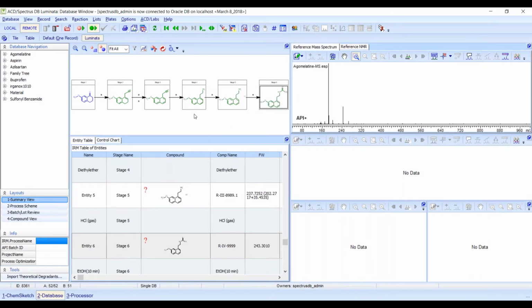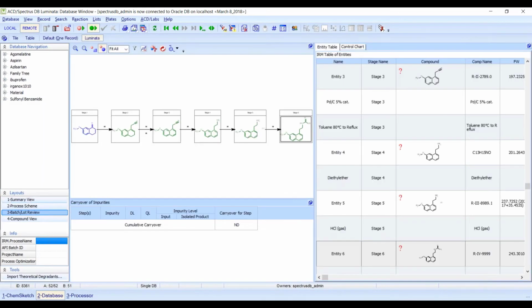Now, in this case for the webinar, I really want to focus on a differing screen form, so maybe more of a process screen form. So you'll note we can have differing screen forms where you can show the data. In this case, I'm hiding that. Maybe I'm not interested in that at this point, but what I am interested in seeing is, let's say, the impurity mapping.